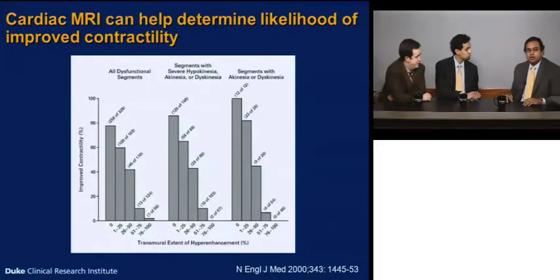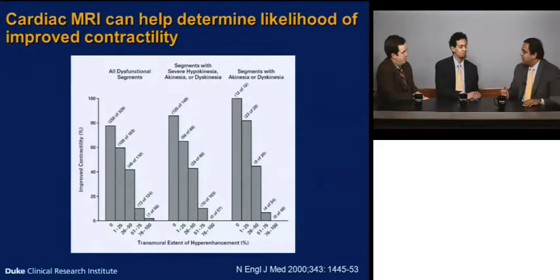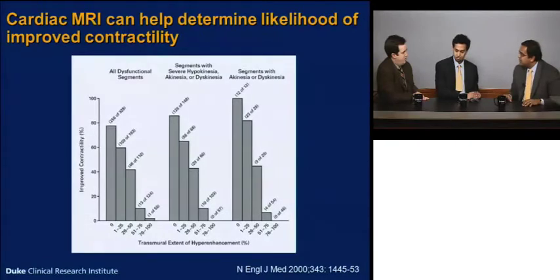Yeah, and what do we say to the person who says, look, I have a 54-year-old patient with 2 occluded vessels and an EF of 40. I was going to send him to 2-vessel CABG anyway. You guys at Duke did a nuclear study and an MRI. Did we need to do that, or should we have just said, let's go to CABG?